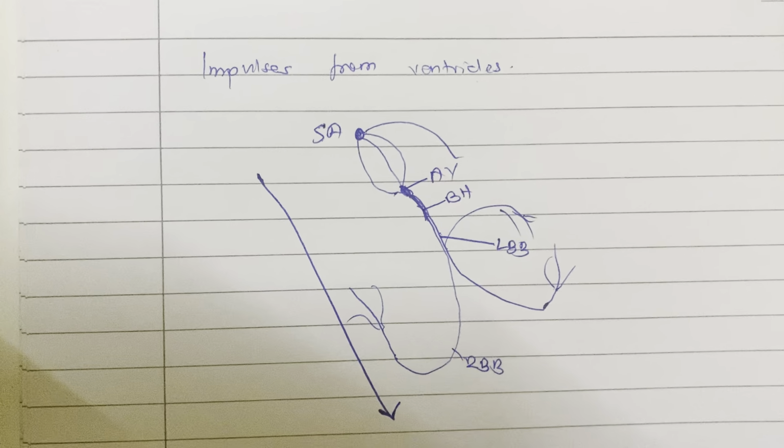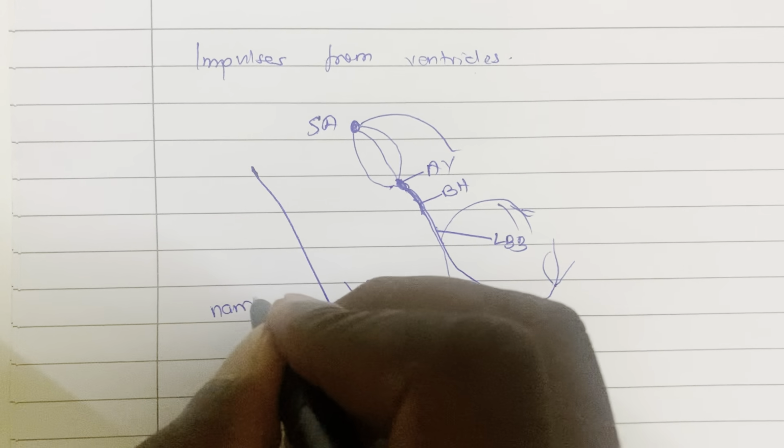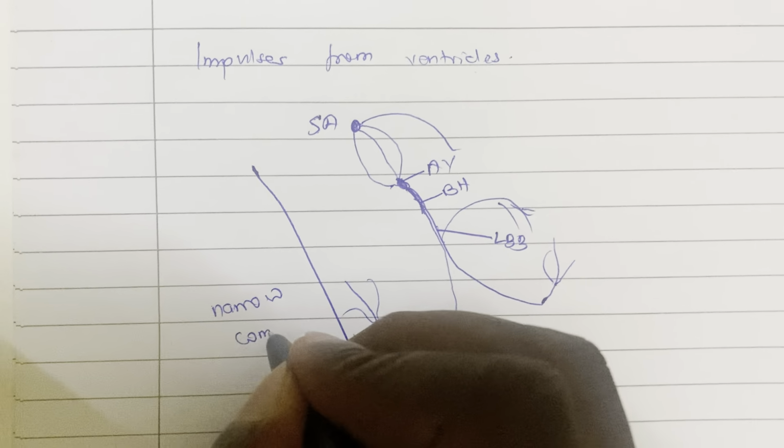This direction will produce narrow complex.